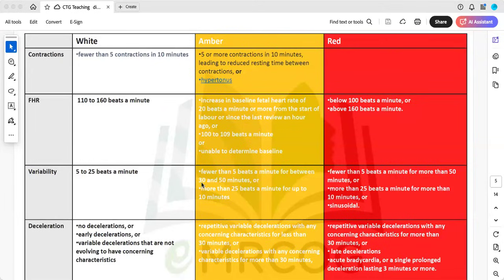Because it can be seen in some situations like prematurity, which is okay, or when the mother is taking opioids or magnesium sulfate in labor. But the most dangerous thing is that it can be an early sign of hypoxia, right? Or an evolving metabolic acidosis. So it's concerning, and I need to follow up and see.